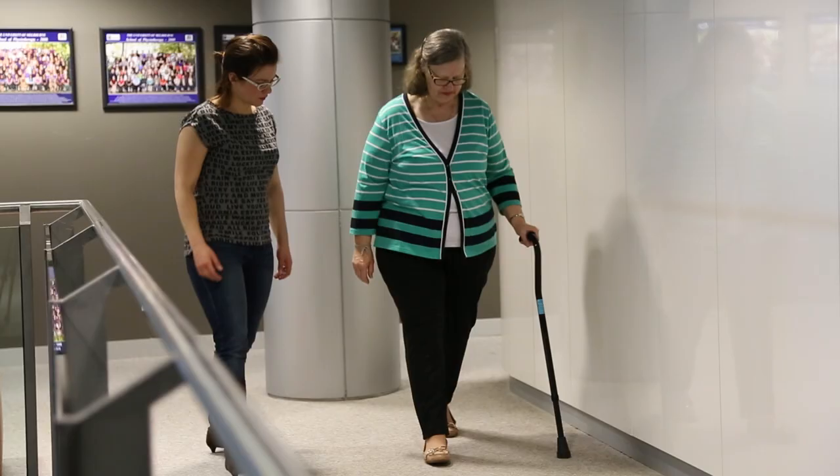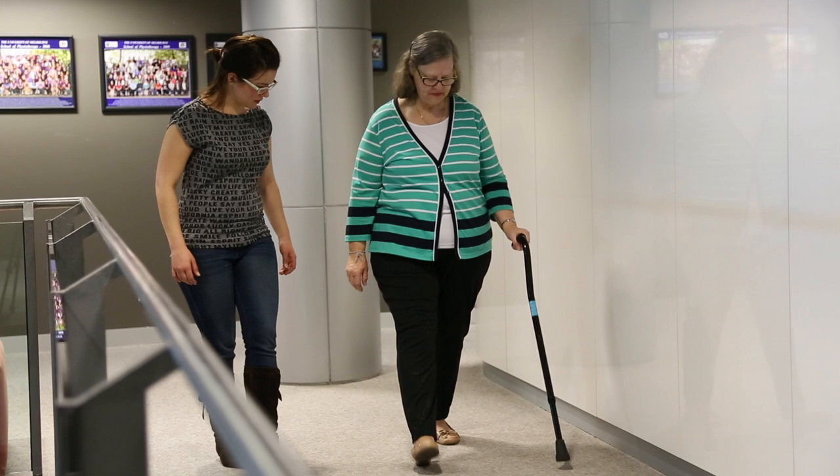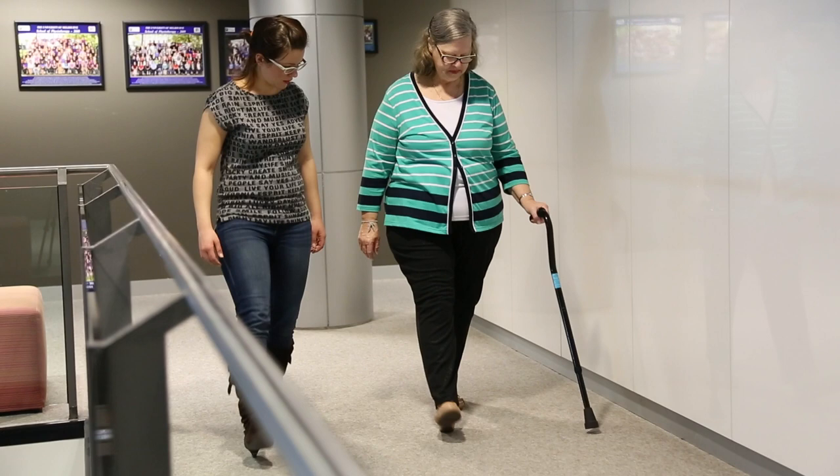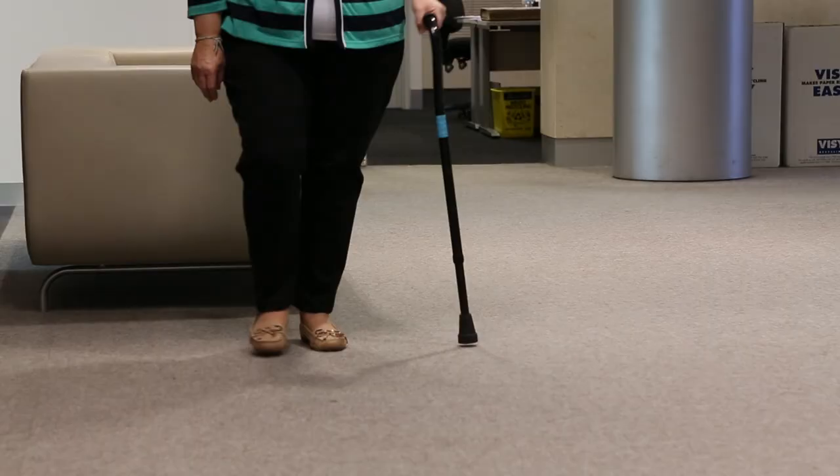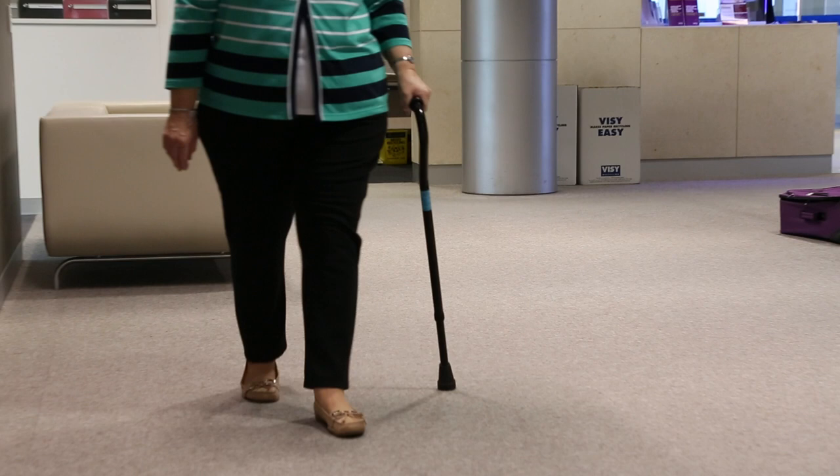The next phase is to use the walking stick correctly. For the purpose of this training exercise, we're going to be using the right leg first, but it doesn't matter which leg you start with normally. The stick should touch the ground just before or at the same time as your painful leg. Remember that the stick is for balance, not for putting all your weight on it. Keep the pressure on the stick the whole time you have the right foot on the floor. Don't lift the stick up early. Once you step through with the left leg, you lift the stick off the floor.